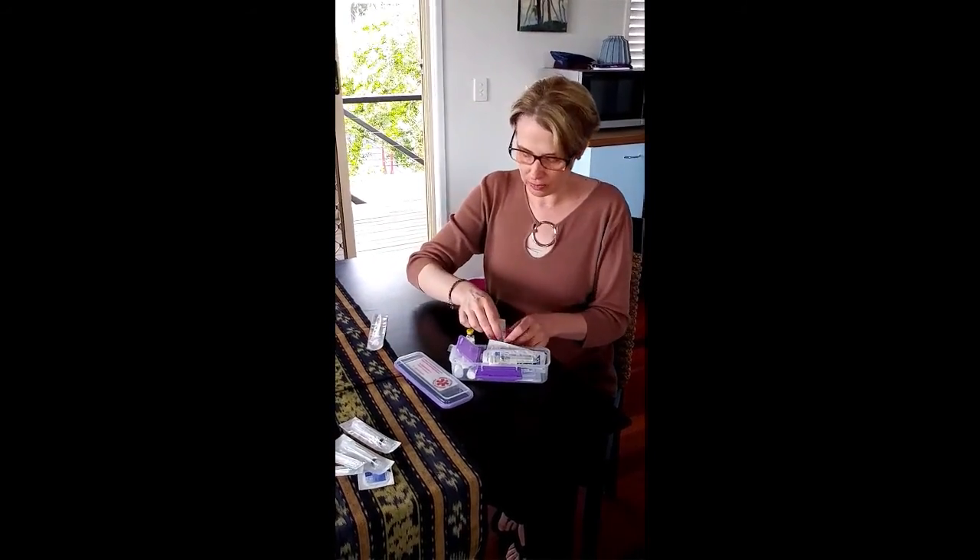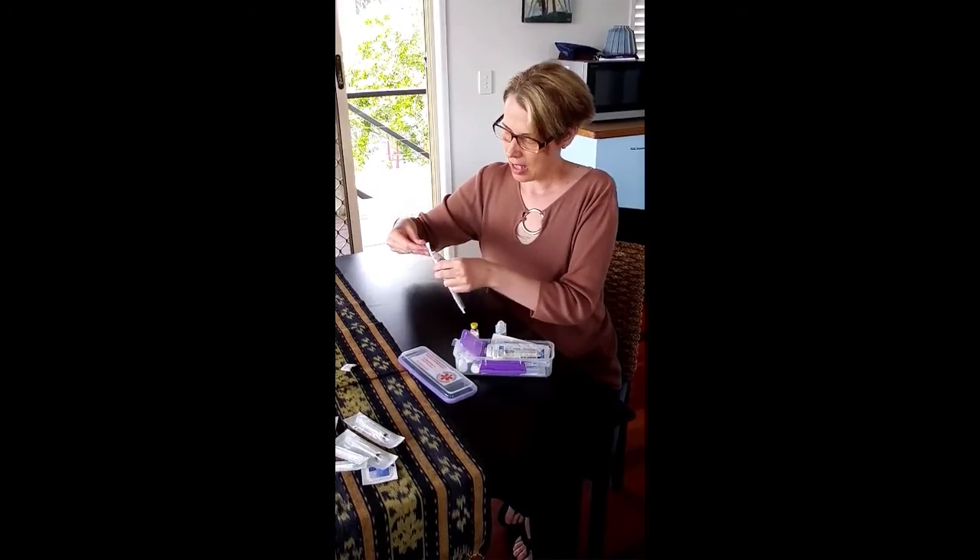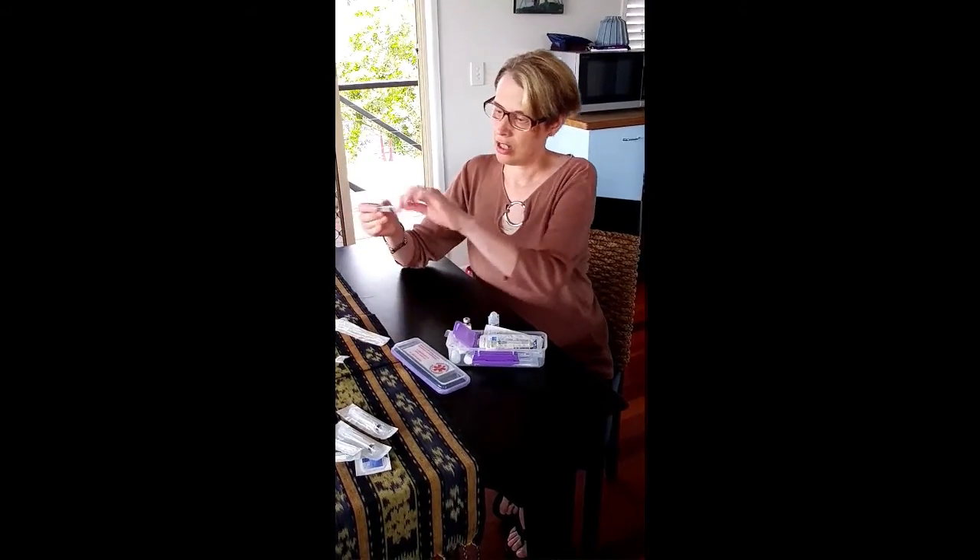You have the two items and the needle. You would first break off the top of your water ampoule and break off the top of your solu-cortef, then take your needle and your syringe.